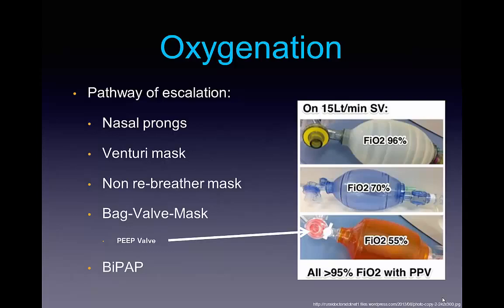This type of ventilation with bag valve mask and a PEEP valve, which provides positive end expiratory pressure when the patient exhales through that mask, reliably generates an FiO2 of 1 or 100%. BiPAP or CPAP can also be used. Another important consideration is that oxygenation, when performed in an upright position or semi-upright position, allows for greater oxygenation and greater apnea oxygenation. It just happens that you're able to expand the lungs properly, and most patients are able to deliver that oxygen correctly to the various lung elements to facilitate pre-oxygenation.